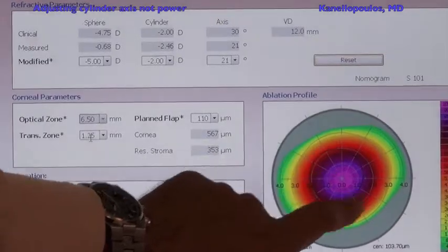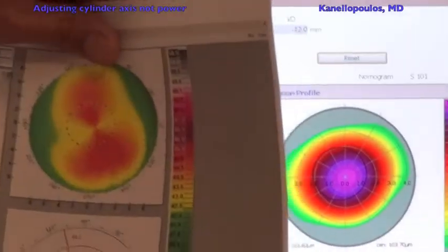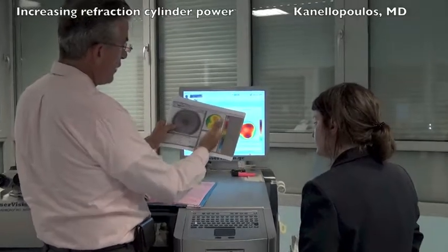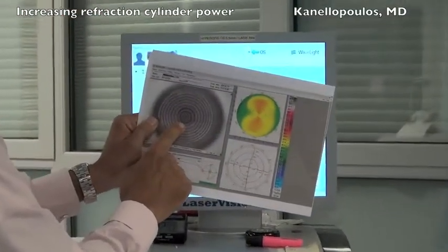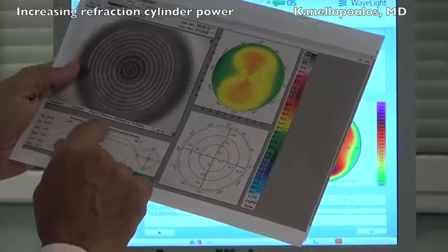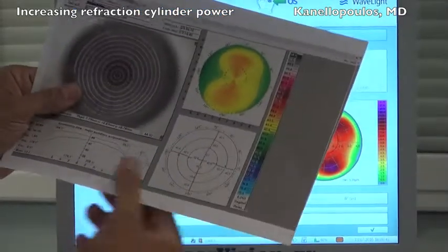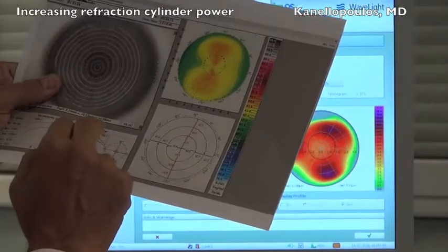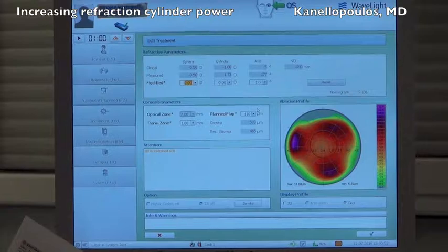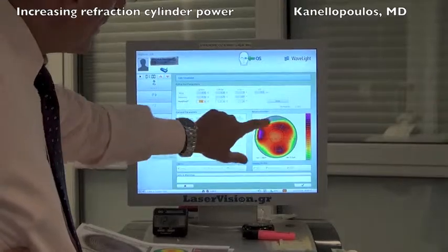You can see here that the pupillary aperture is eccentric to the center of the ablation in order to compensate for the angle kappa that we invariably see even in these low or moderate myopes. This is some very regular astigmatism. Everything looks perfect, right? But we have angle kappa here as well. You can see the XY deviation for the pupil to the cornea apex is 0.03 millimeters on the x-axis, not much, 30 microns. But on the y-axis, we're 0.28 millimeters. This is 280 microns decentered on the vertical axis, and you can see the topographer trying to compensate for this.